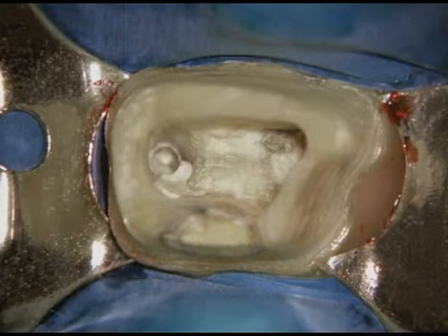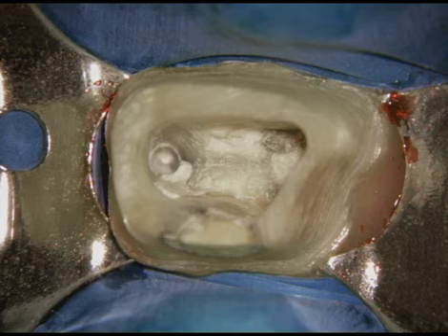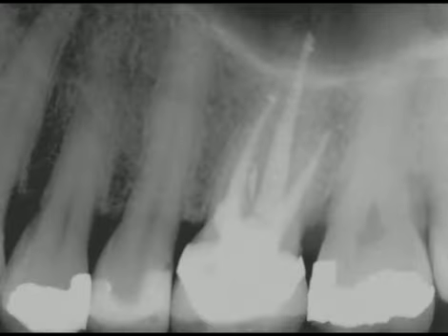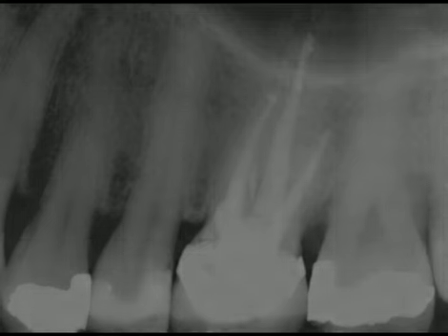These combined efforts result in post removal. Again, we can visualize the MB1 orifice, related groove, and a likely MB2 system. An off-angled radiograph reveals a well-packed resorptive defect, a furcal canal, and the PFM crown provisionalized. It's good to see on a 4-year recall that there's a new restorative and endodontic healing has occurred.